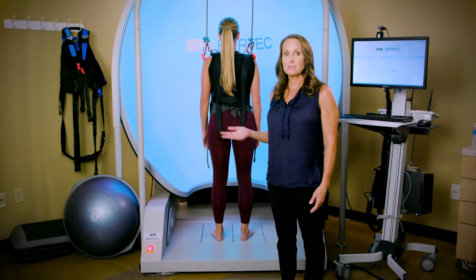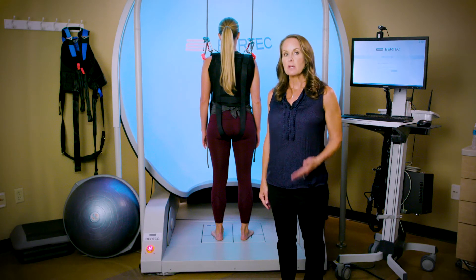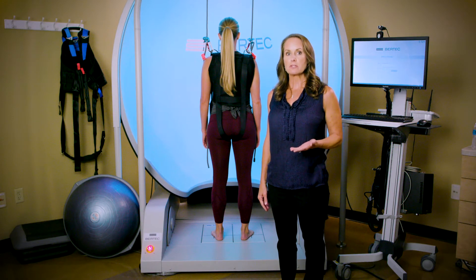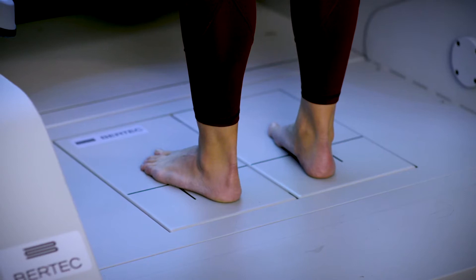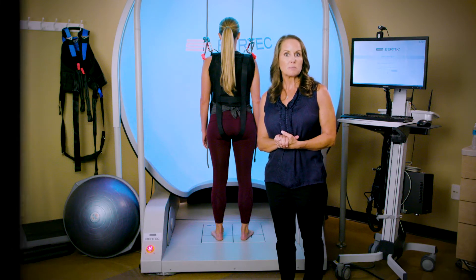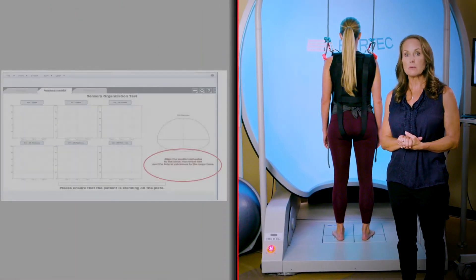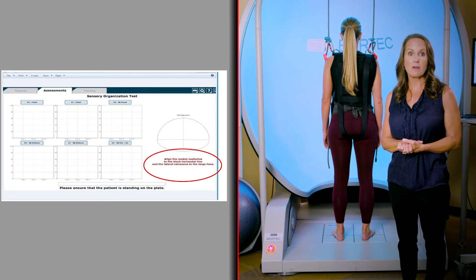Once they're safely secured, you will need to properly place their feet on the markers on the floor of the system. The CDP will display instructions for you on how to do this each time. The first thing to do is determine which of the three vertical lines on the force plate to use based on your patient's height. The system will tell you which black vertical line to use — small, medium, or large — based on their height.